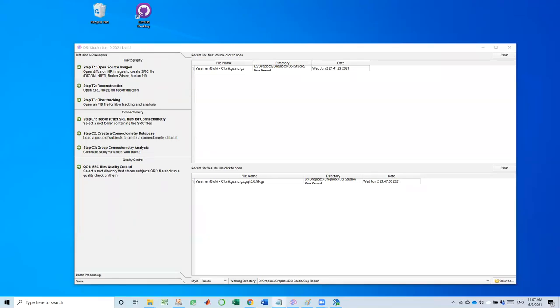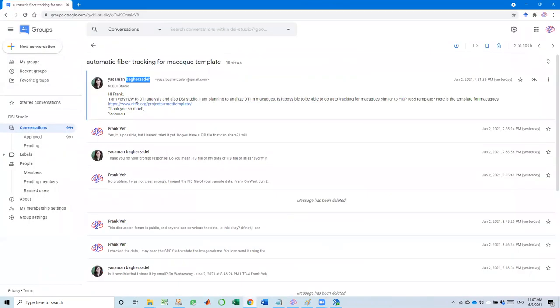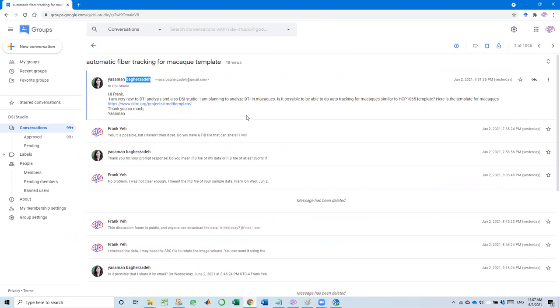Hi. In this video, I'm going to show how I troubleshoot DWI data. Yesterday, in the DSI Studio forum, I saw a message from SMM Bokasade. She said she's very new to DTI analysis and also DSI Studio, and is planning to analyze DTI in macaque.